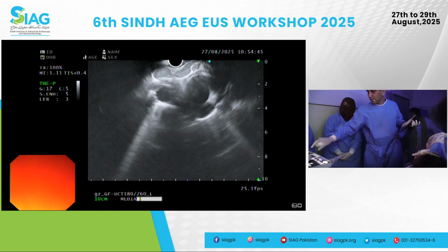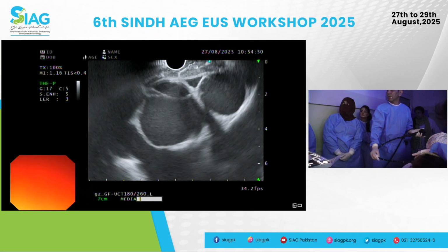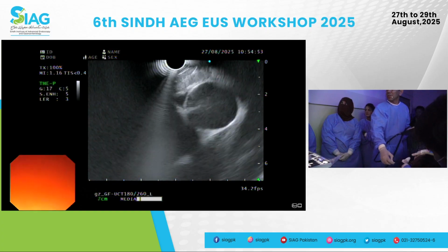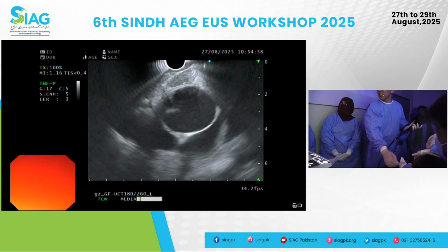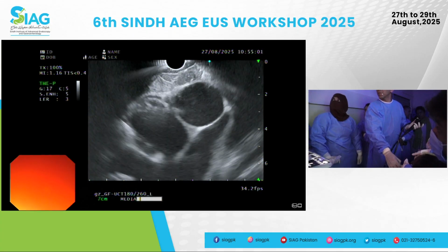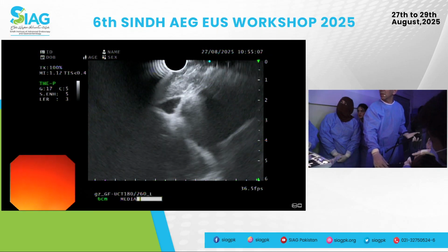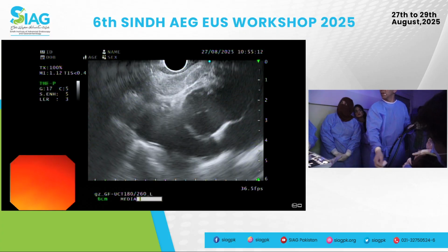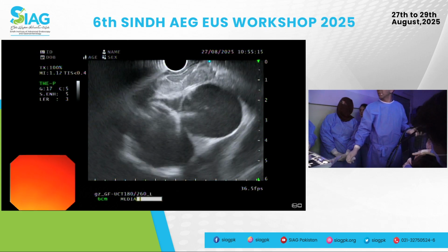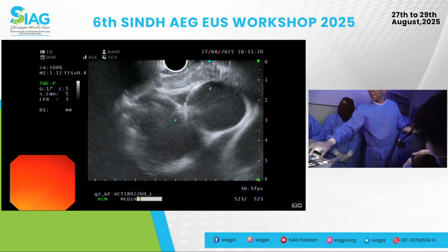Do we have some mediastinal nodes? So there are some nodal structures there. It's got a fatty hilum and it's not hypoechoic, it's not round, it is elliptical. It may be enlarged, but freeze it. In the short axis, it doesn't appear to be dilated.